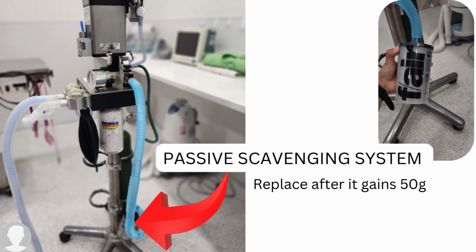Next, we have the passive scavenging system, which will neutralize waste anesthetic gases. It must be weighed every time you use your machine and replaced after it gains 50 grams.